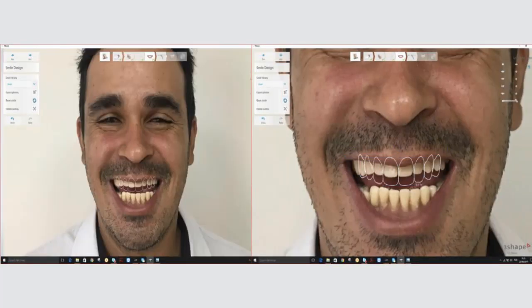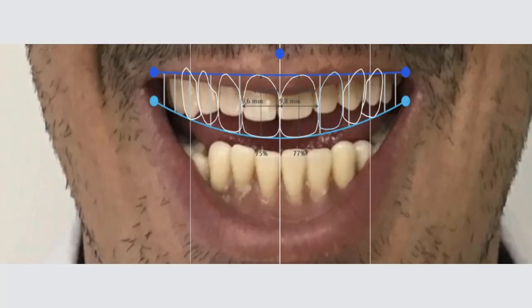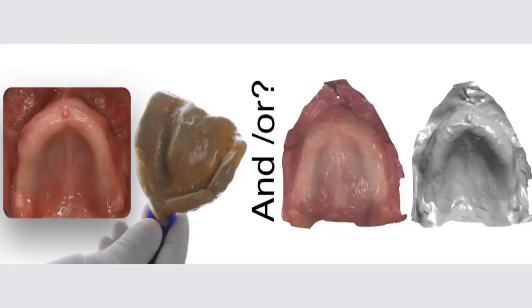So you come and give some idea of what would be the ideal proportion for this patient. And those numbers are very important for me. Although you are not seeing papilla, what I would like to see is the alignment of the lower lip, how this would fit, and how the proportion of this tooth would help me in giving that information to produce my denture.